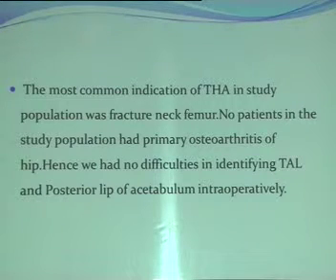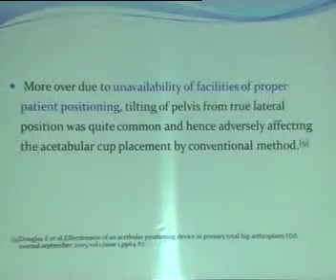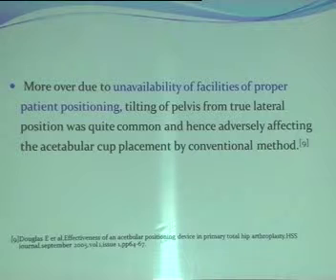The most common indication of total hip arthroplasty in our study population was fractured neck of femur. No patients in the study population had primary osteoarthritis of the hip. Hence, we had no difficulties in identifying the transverse acetabular ligament and the posterior lip of the acetabulum intraoperatively. Moreover, due to unavailability of facilities for proper patient positioning, tilting of the pelvis from the true lateral position was quite common, and hence adversely affected acetabular cup placement by the conventional method.